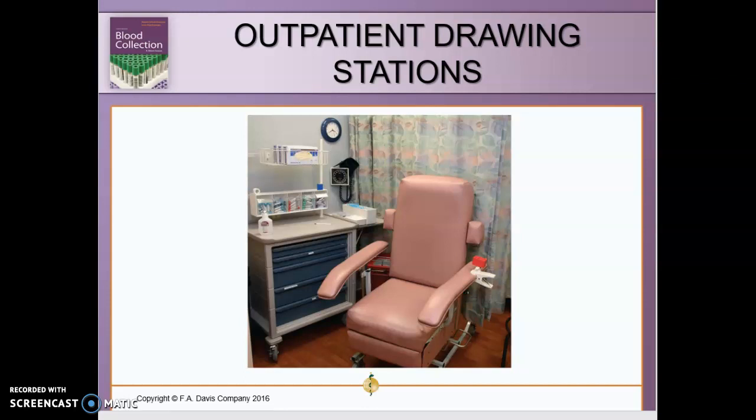If a patient has a history of fainting and they tell you, I can't stand to have my blood collected, if they have that history of fainting, we automatically lay the chair back and secure them in the chair before we actually perform the venipuncture.